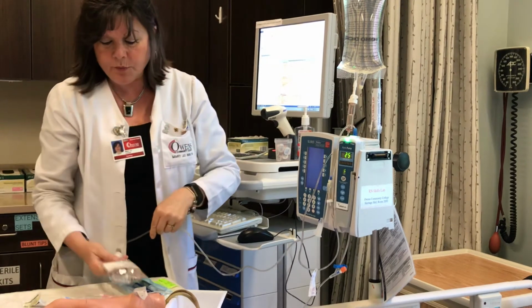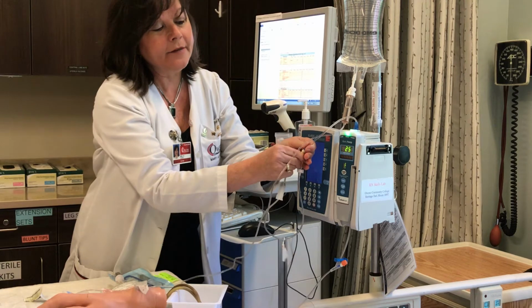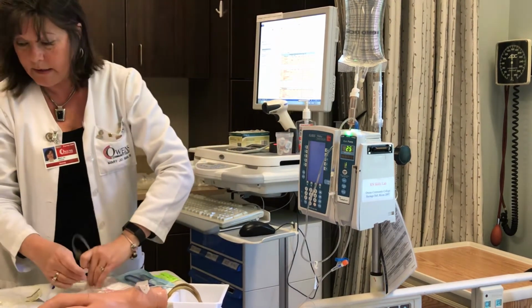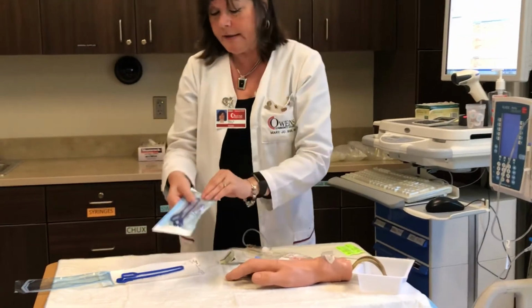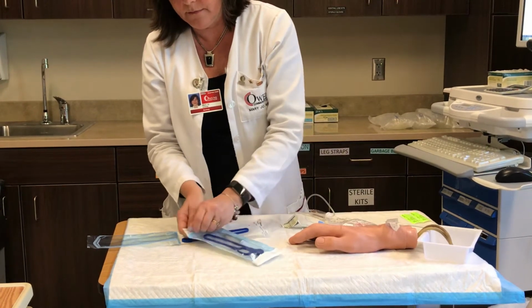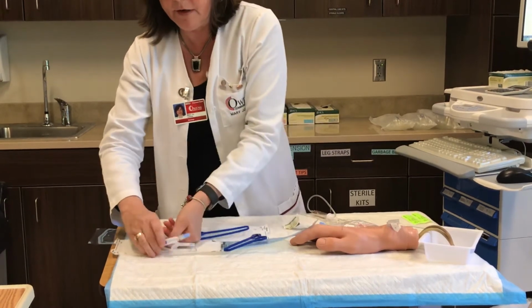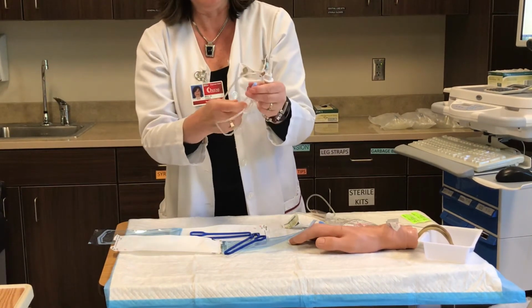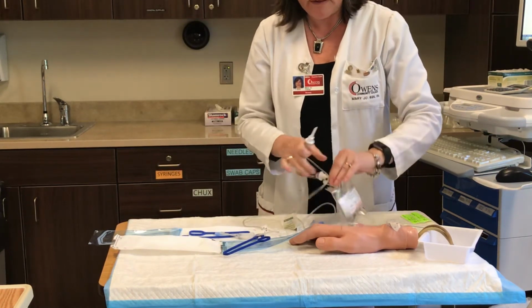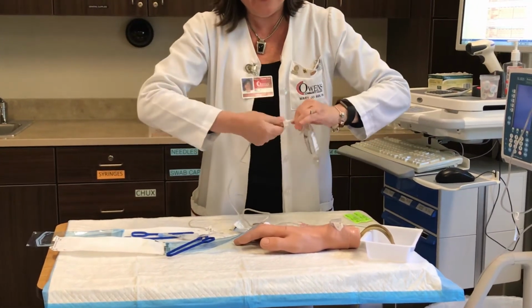The other way to prime your secondary tubing, now I'm going to disconnect this to demonstrate straight prime, is you would open up your secondary tubing as I did before. And again, the first thing I'm going to do is close that clamp. I'm going to attach the tubing to my piggyback without contaminating the connections.